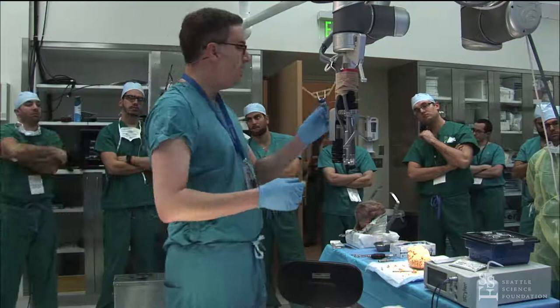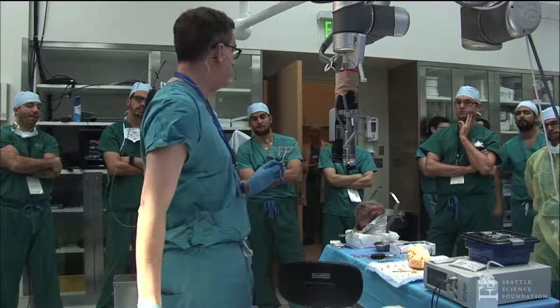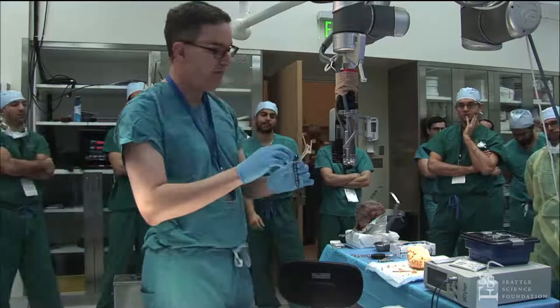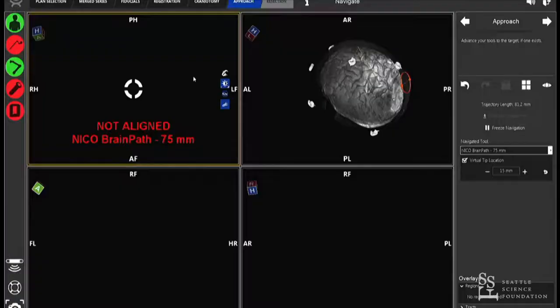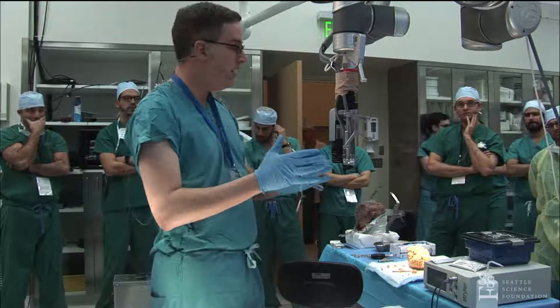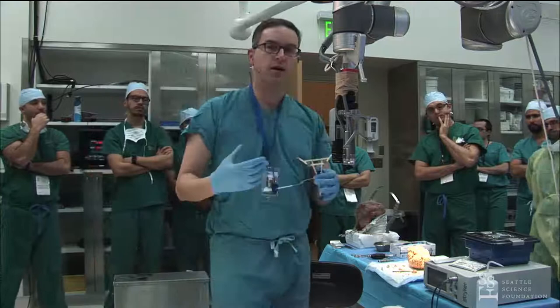Another difference with this system is a tracker that attaches directly to the tube. With a standard system, once you're at target you lose navigation. With this system, you take the trocar out and you're still tracking your tube in terms of position, angle, roll, pitch, and yaw at all times. It also projects what size and length trocar you need, and maps out how much play you'll get based on your craniotomy size relative to the lesion.